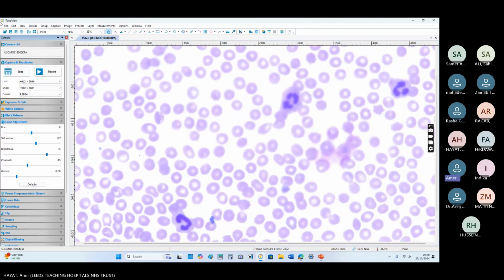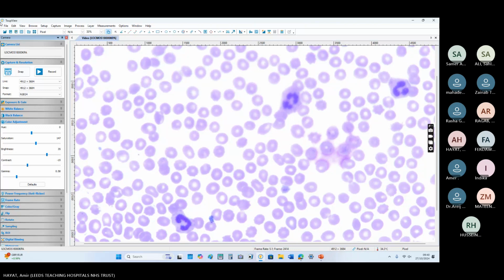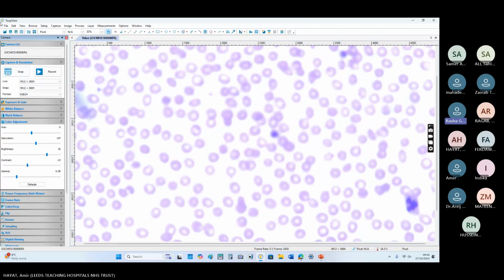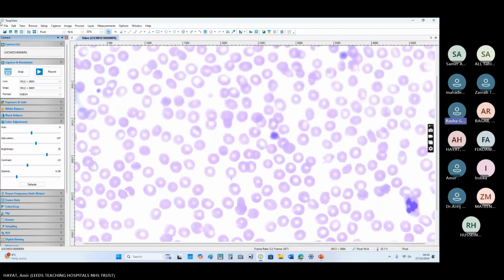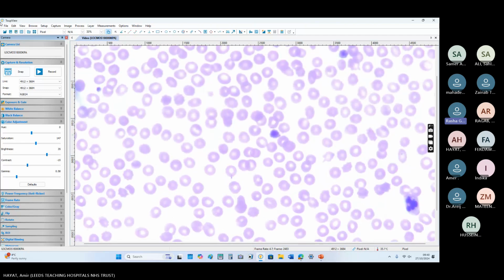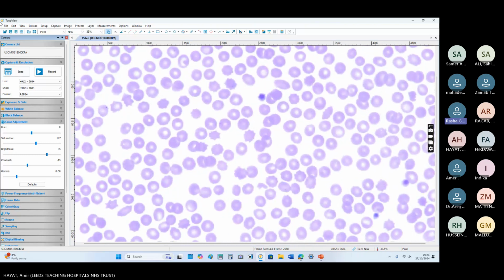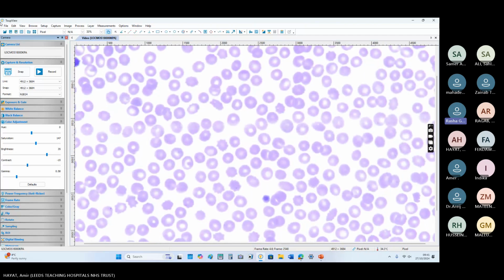Okay. So that's why I asked you, would you like to ask me any question at this point among the investigations? Yes, the blood film shows left shift also for the neutrophils. I see band forms, some activated lymphocytes, large platelets, mild thrombocytopenia. Otherwise, he has normocytic, normochromic RBCs.